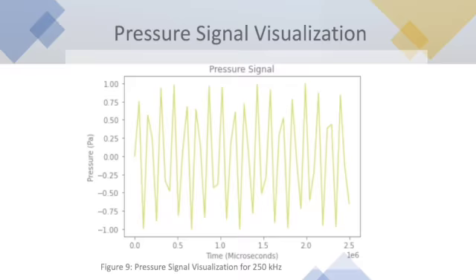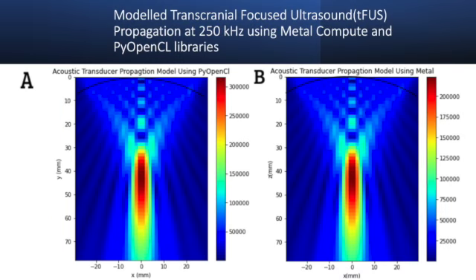Here is the comparison between the two models. At first glance, these models appear to be identical as they have their focal points in the exact same spot, from around 37 to 49 millimeters in the dark red on the y-axis. The color bars differ on a very trivial scale, so this may present minor differences, but they will not be significant. The black line on top of the models acts to show where the transducer will converge its beams from.